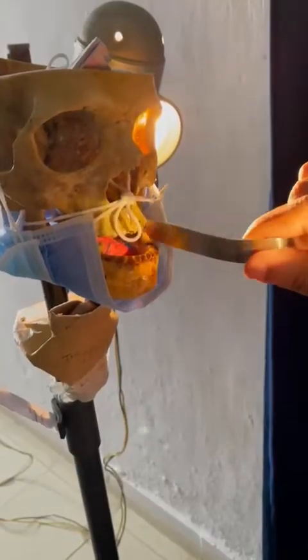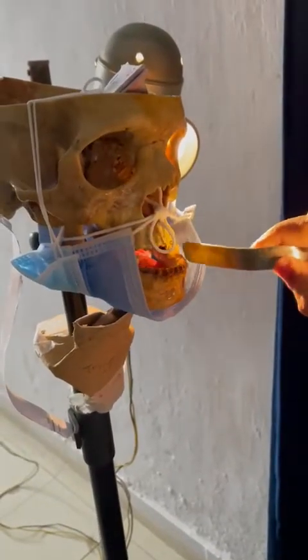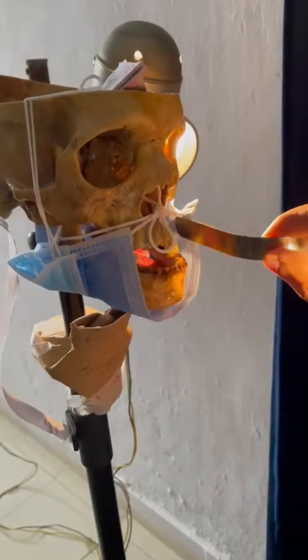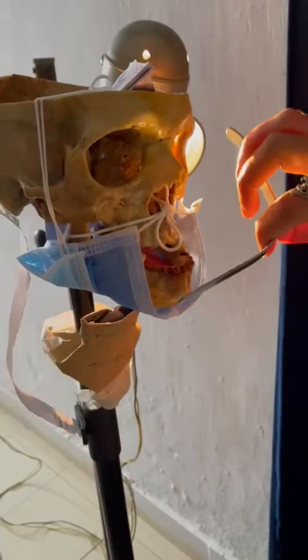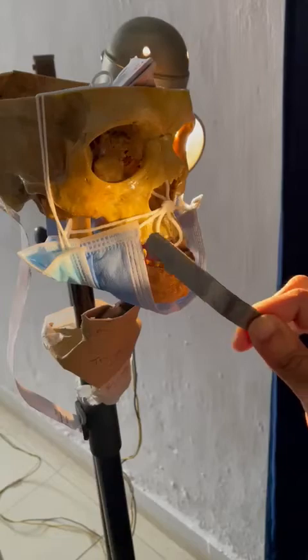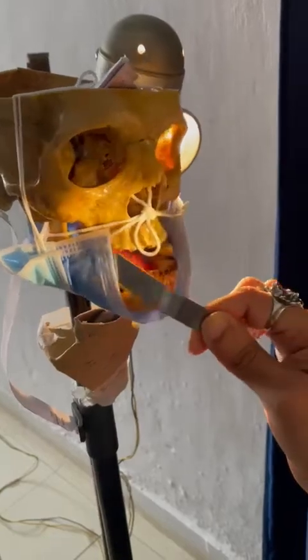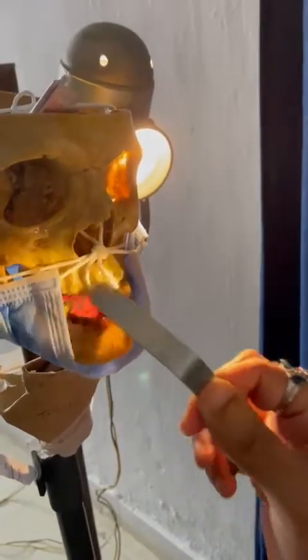This is the angle of the mouth. This is the sulcus — the gingivo-buccal sulcus. Here, if you take the lips, it will be the gingivo-labial sulcus. Retract the lips like this on both sides so you can visualize the area.